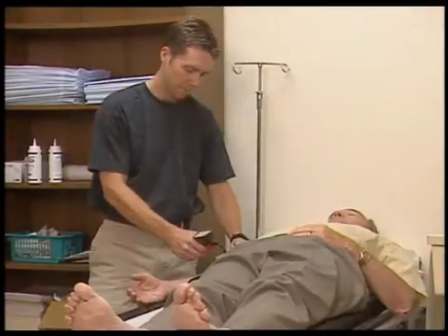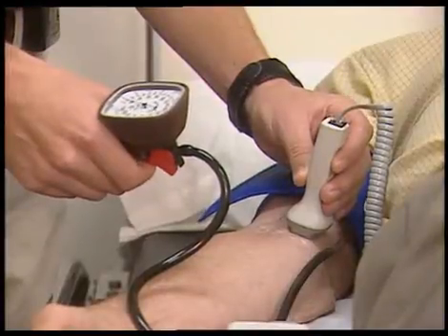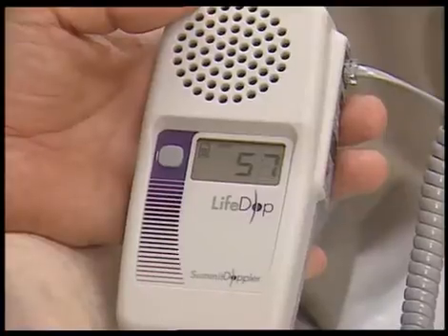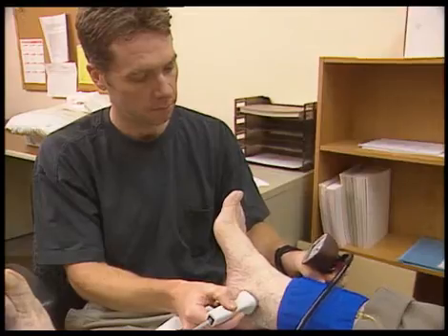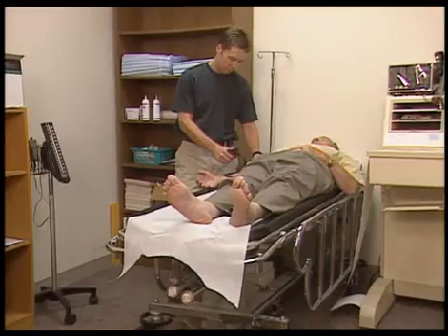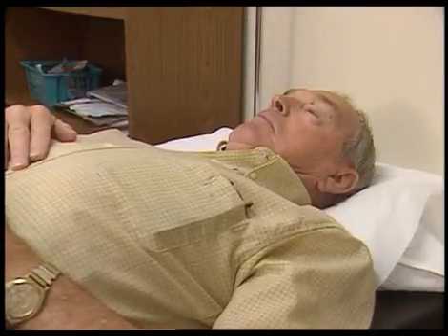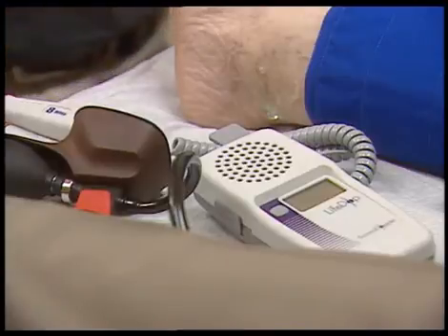The ABI examination is a relatively quick exam comparing the systolic pressures in the arm and the ankle. It can be done in the office using a simple handheld ultrasound Doppler and standard blood pressure cuffs. To prepare the patient for the test, have them remove their shoes and socks and lie quietly on the examination table for a few minutes in a warm examination room. Before starting the measurements, arrange your equipment in a convenient position and make yourself comfortable to avoid awkward positioning.